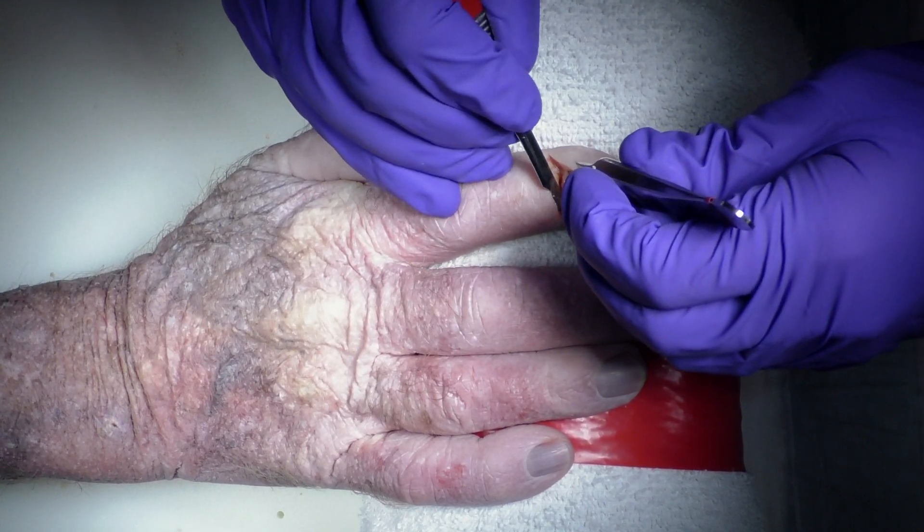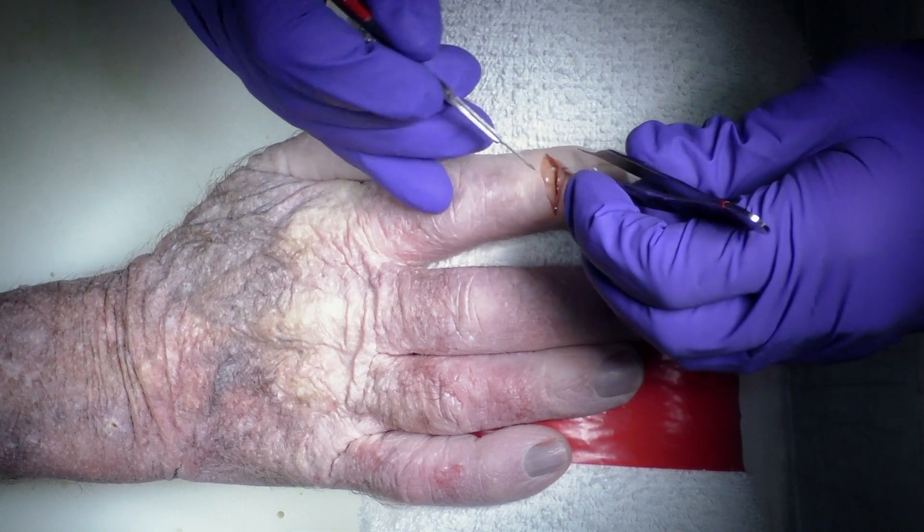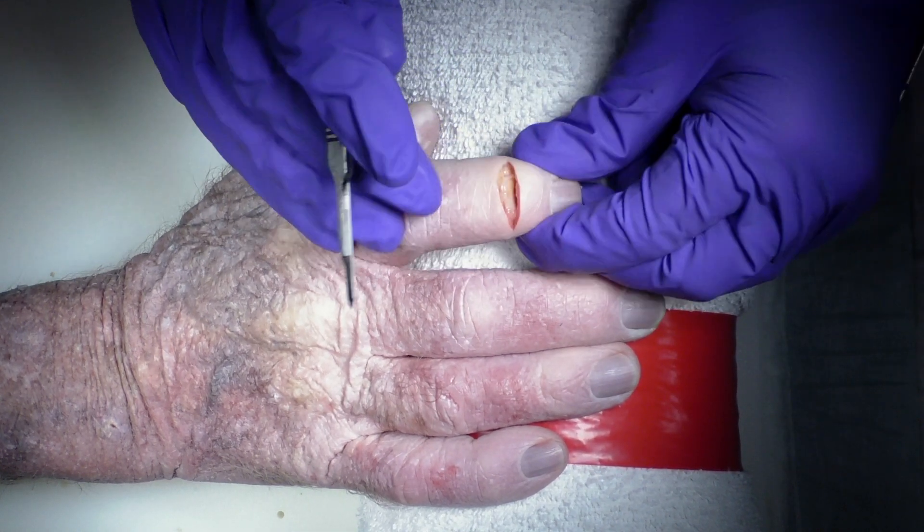As we get the joint exposed, sometimes releasing some of the collaterals, we can now appreciate the joint.